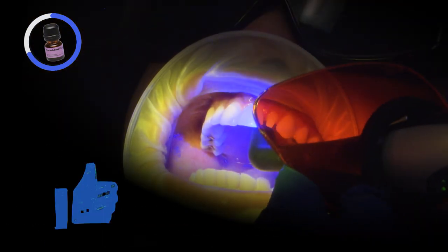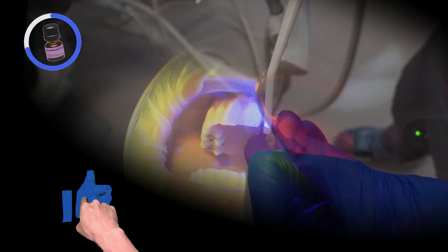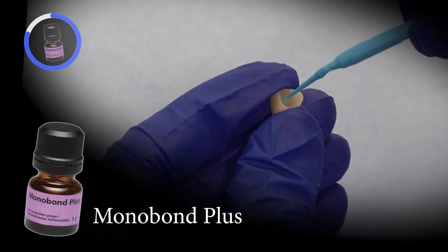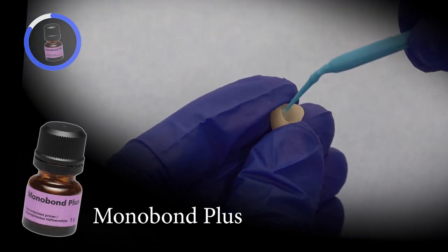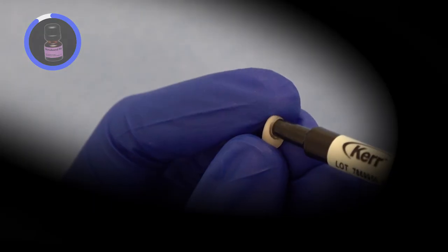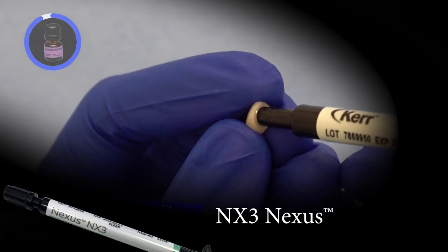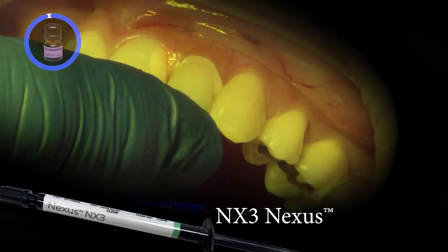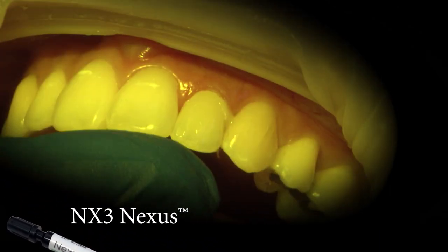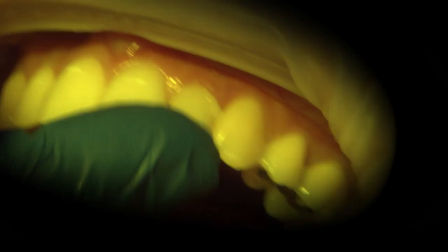The inside of the crown was previously etched with hydrofluoric acid by the laboratory to create micro-mechanical retention. Chair-side, the inside of the crown is treated with Silane by Monobond Plus to act as a coupler for the crown to the cement. I used NX3 Nexus 3rd Generation Light-Cured Resin Cement to bond the crown onto the prepared tooth, giving me a flexible setting time to correctly position the restoration.